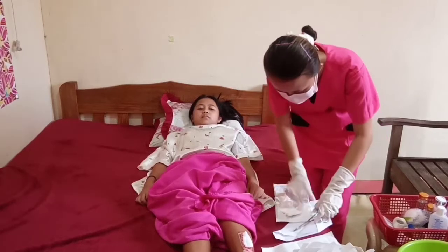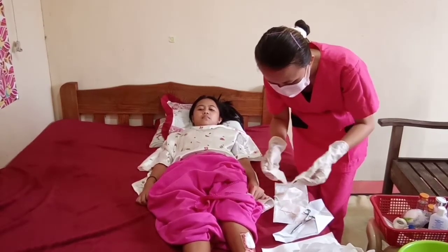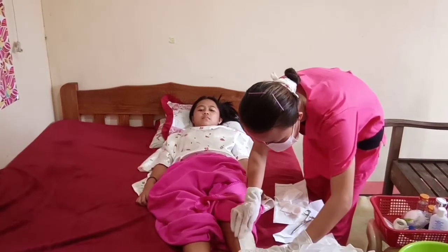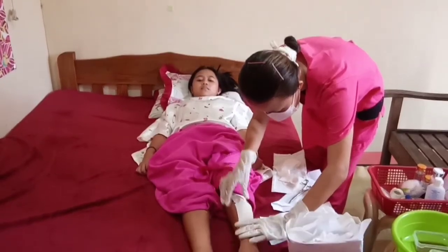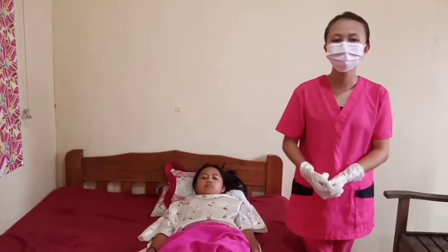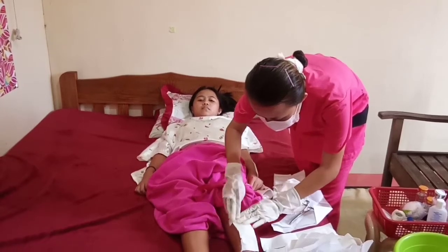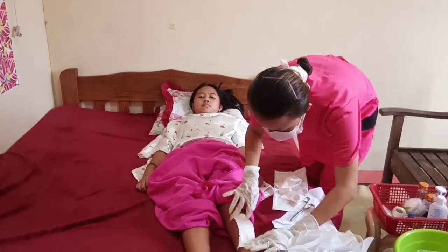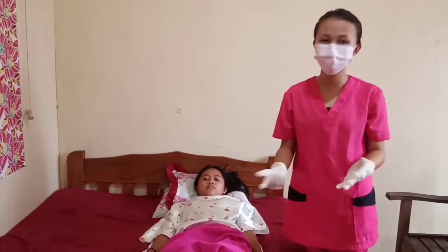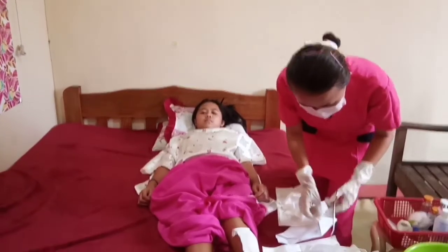And then we're going to apply the first layer. And then after that, apply the second layer of gauze. So I already put the second layer of the gauze here. And lastly is apply thicker woven pad. So I have here the sterile woven pad. So let's apply.